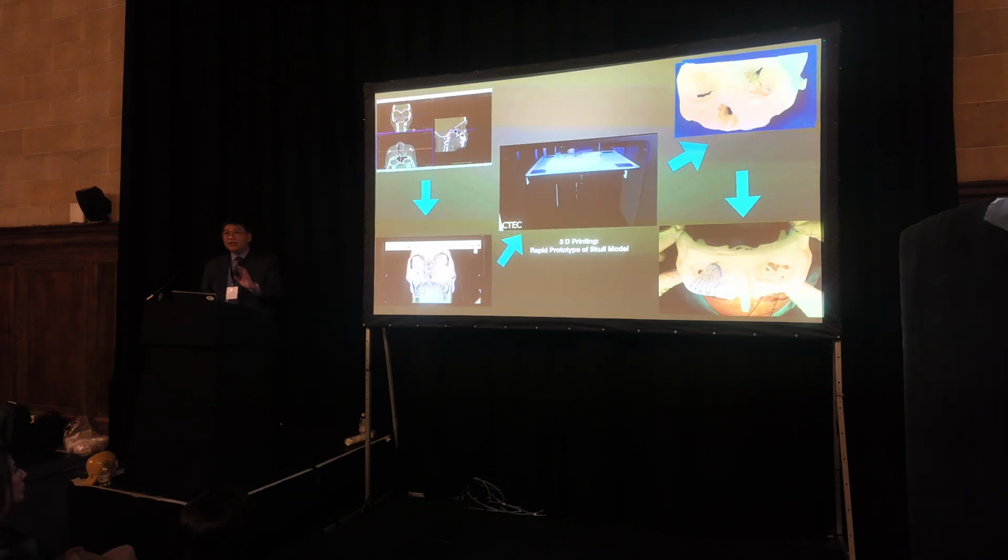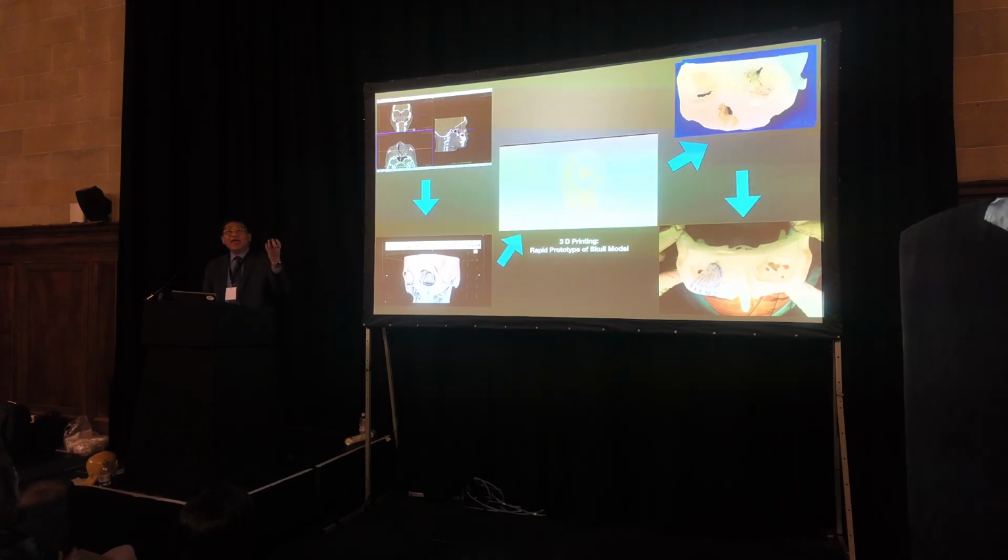In addition, this lady had a motorcycle accident and has a very bad fracture. So it's going to be a tough one. Lastly, nowadays, I do encourage you to use the CD-ROM, learn by yourself at home with the software, and get the rapid prototype every time as much as possible. It shortens the surgical time and makes it more precise.